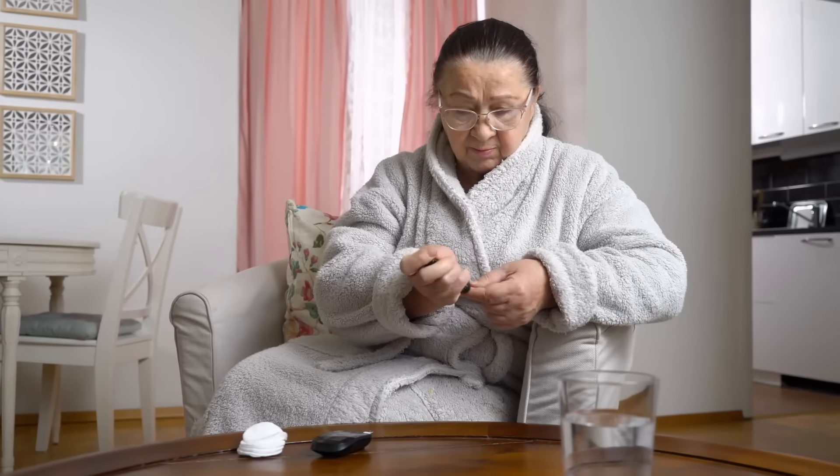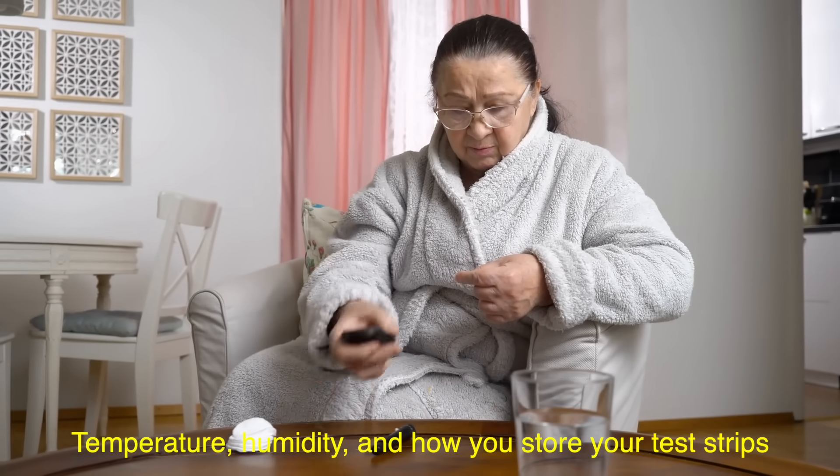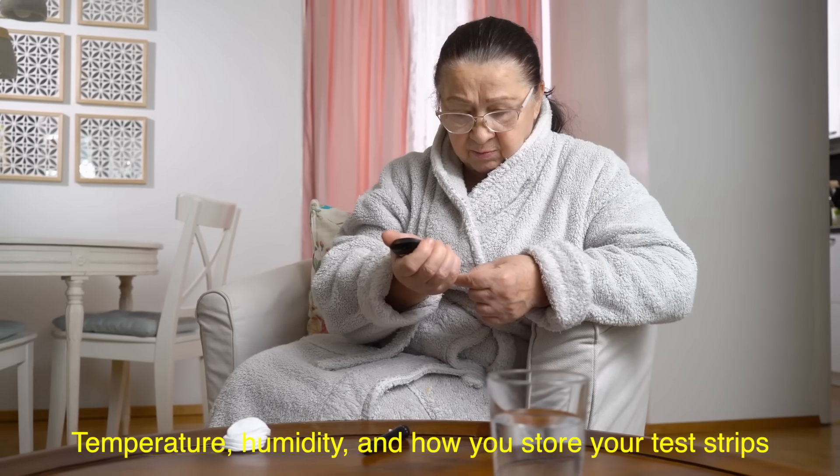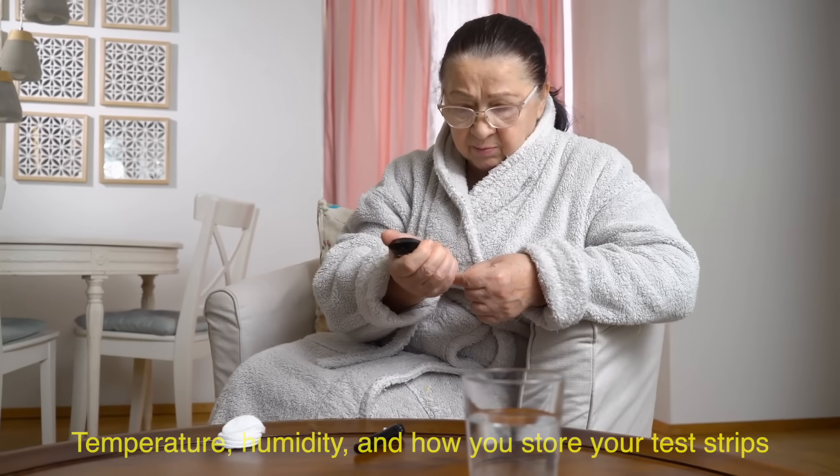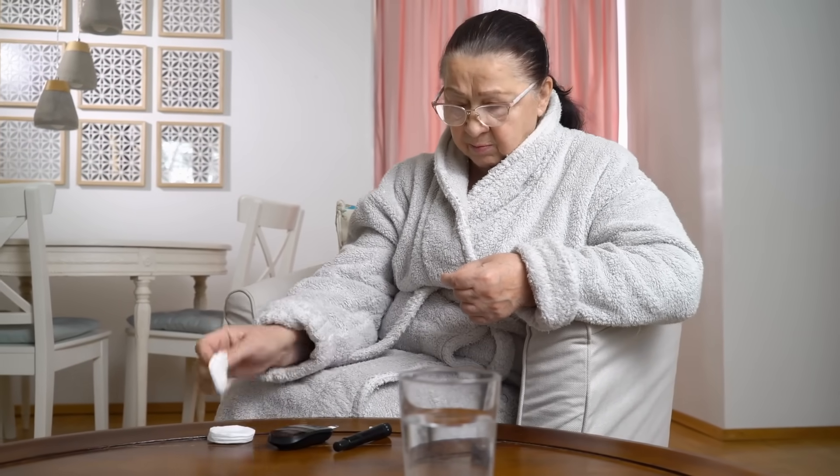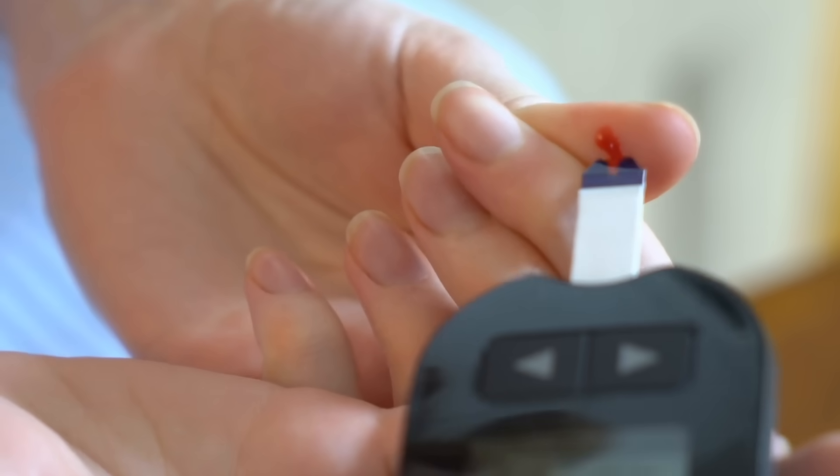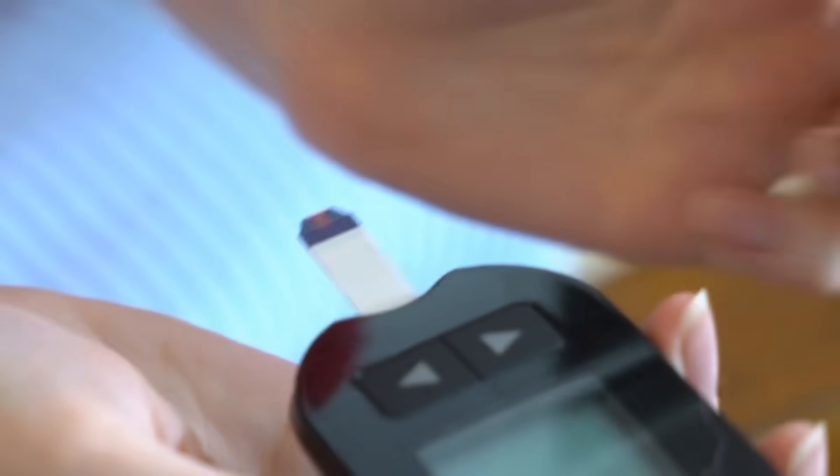However, no device is perfect. Factors like temperature, humidity, and even how you store your test strips can affect accuracy. That's why most manufacturers recommend using fresh strips and storing them in a cool, dry place. Regularly comparing your glucose meter readings with lab results can also help ensure consistency.